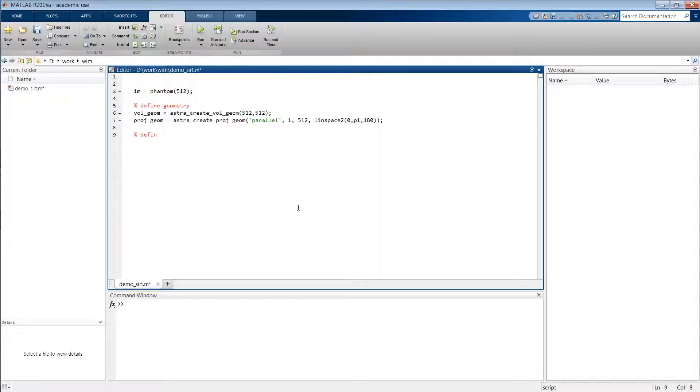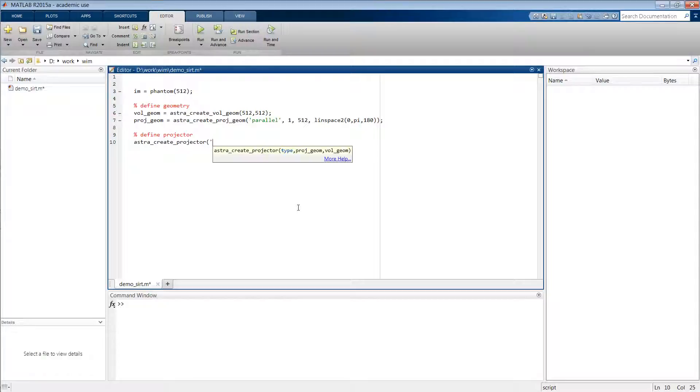Subsequently we have to define the projector object, and we do this by typing astra_create_projector. In this case let's say we want the linear or Joseph's kernel. Here you can also write 'line' for the line kernel method and 'strip' for the strip kernel approach.